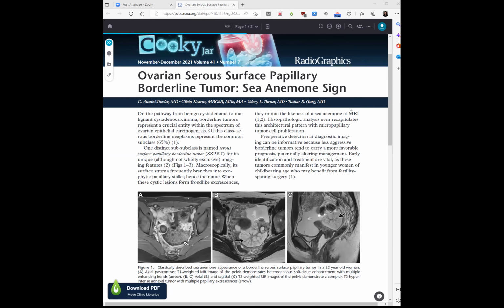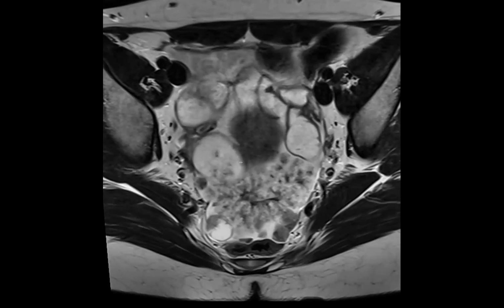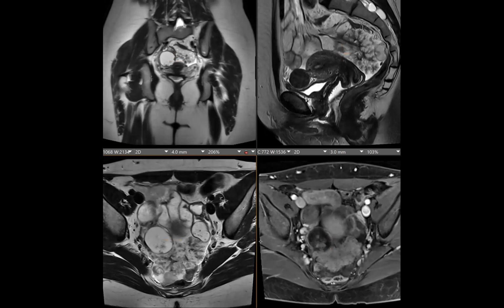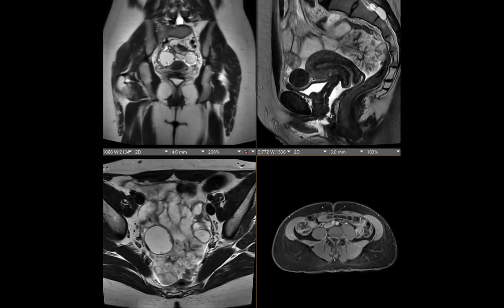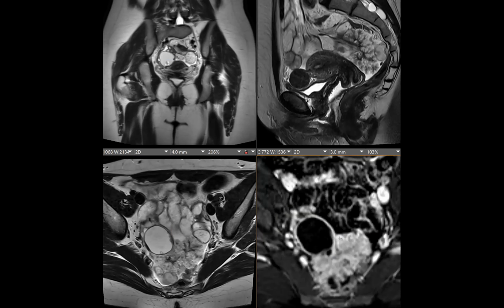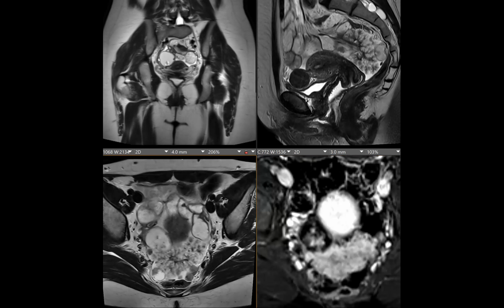Let me share again, one second, and we can look at it together. Okay, you mentioned the right ovary, maybe here? Let me look at the post-contrast. They are not enhancing, right? I would say they are. I don't know. Let me look at the subtraction. Yeah, I think they are. Right there, maybe. I think this is just part of the lesion that we're seeing on post-contrast and not plain, rather than within that right cystic follicle.